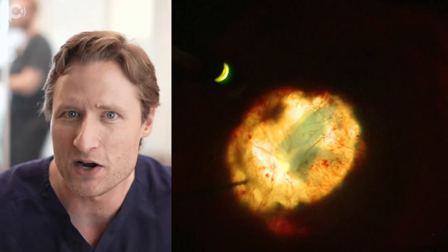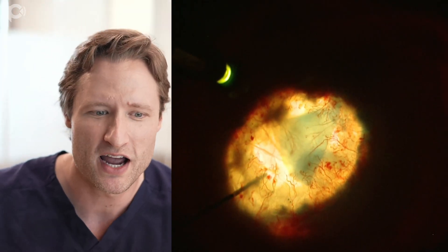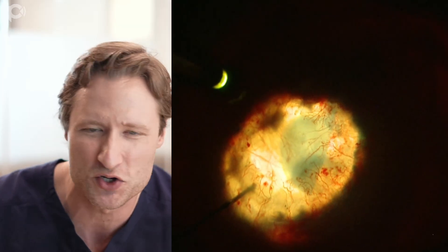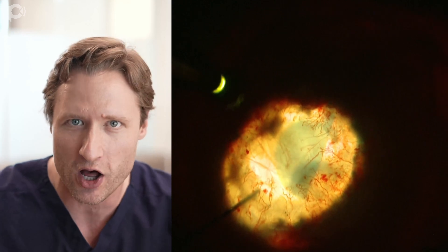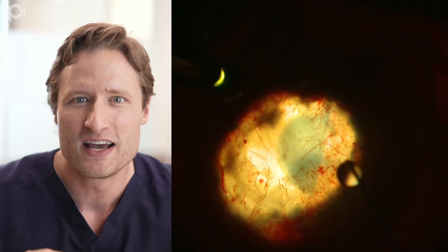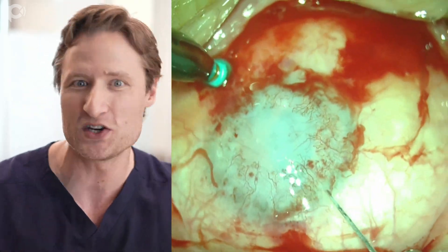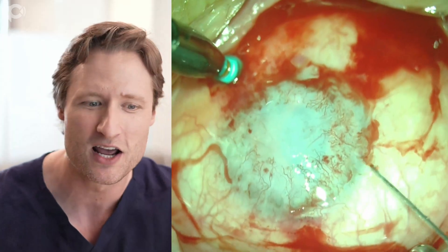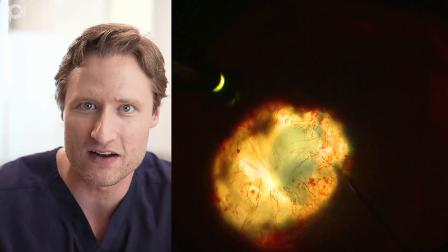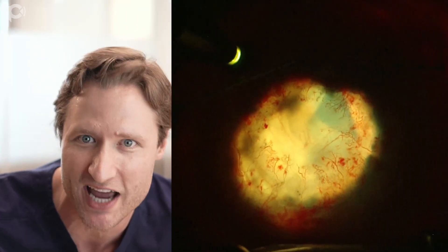The graft looks like it's smeared between the back of the cornea and the front part of the patient's implant lens. They have an IOL, which is poorly visualized here, but the graft is caught between those two surfaces. I'm injecting fluid, but inappropriately I'm directing that fluid at the graft. When you inject fluid at the graft in the cramped confines of the chamber, it pushes the graft over into the angle, which is what's happening right now.